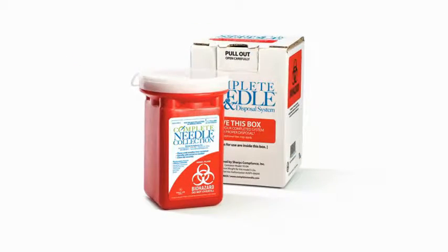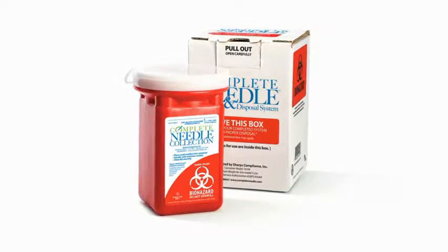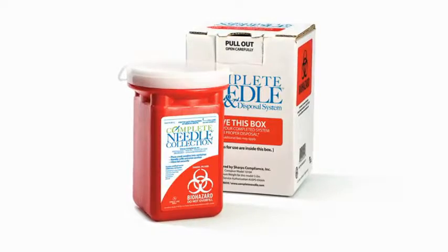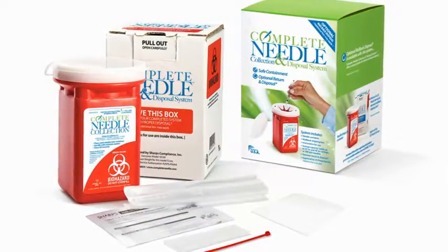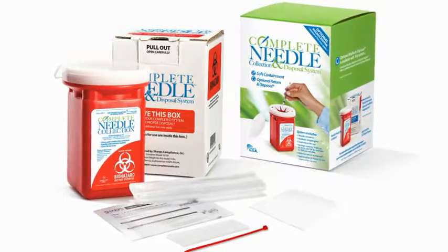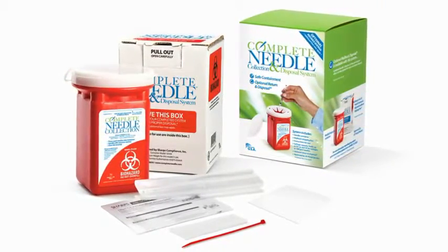This is the box you will use to return your container for proper disposal if using the return and disposal option. Additional fees may apply. Always be sure to follow local and state sharps disposal laws. If you lose this box, simply purchase a new system and use that return box. Containers can only be shipped in pre-approved return shipping boxes provided by the Complete Needle Program.